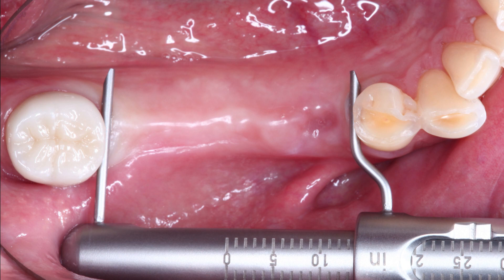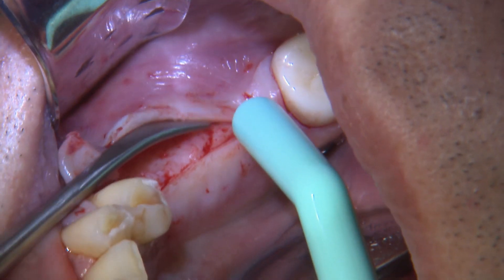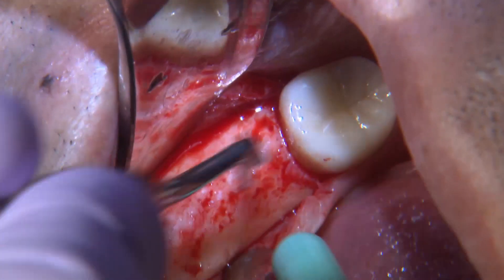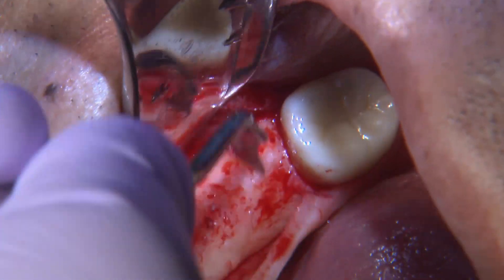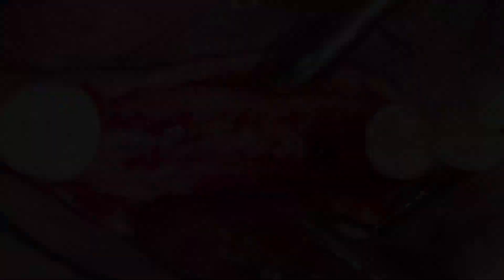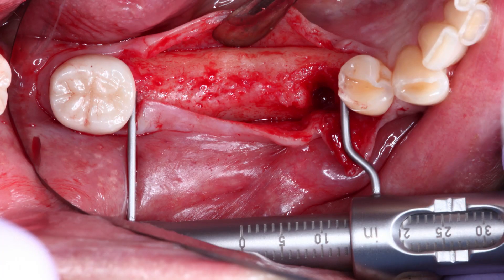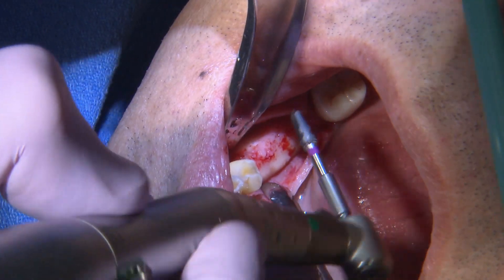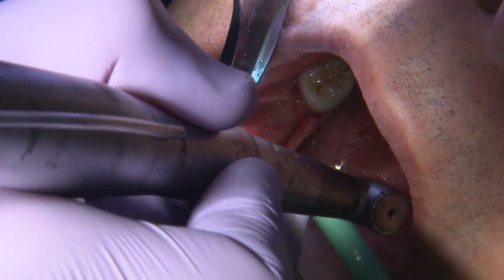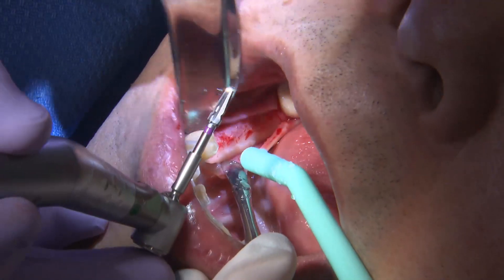I can take care of that defect, which you'll see in just a second. I go ahead and get the patient anesthetized and reflect a full thickness flap, and I clean the ridge of any soft tissue. I want to make sure that I don't have any soft tissue on my ridge. And there you can see that in the area of number 29, I have a defect. So I want to go a little bit more distal. Part of the treatment plan — which is going to be a little bit more challenging — is whether we can get a screw-retained restoration or not, and I will present that later in this video.